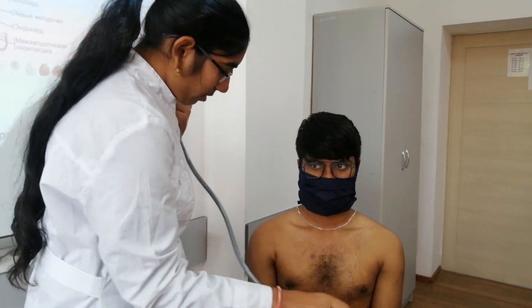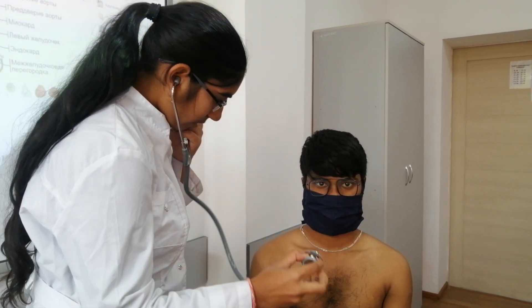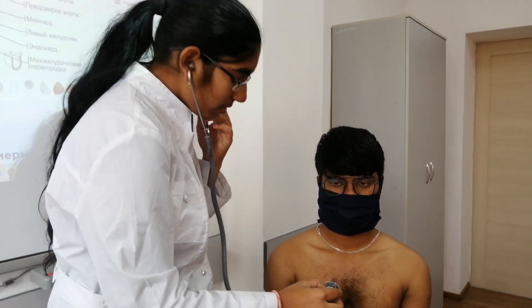Next point: right side of the sternum. Which intercostal space? Second intercostal space. Listening.